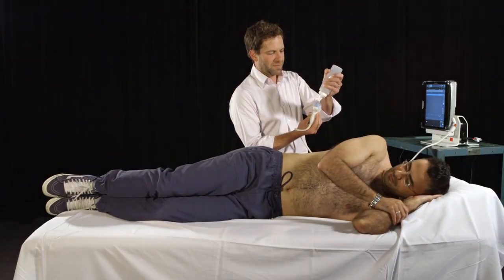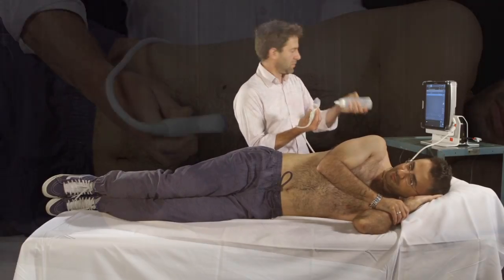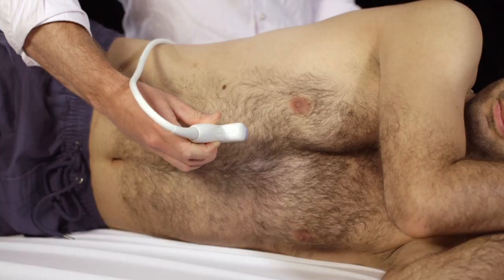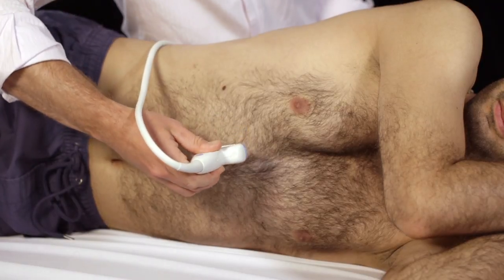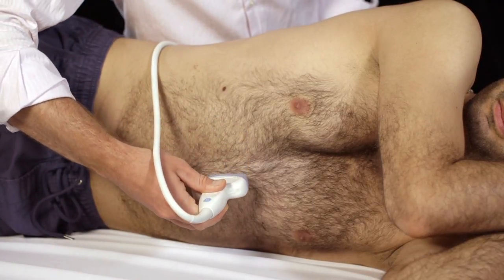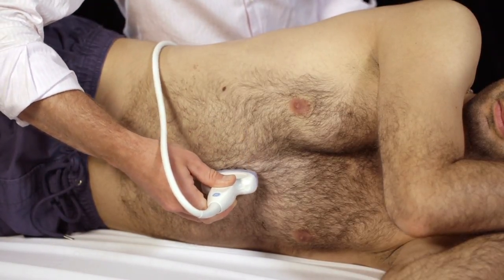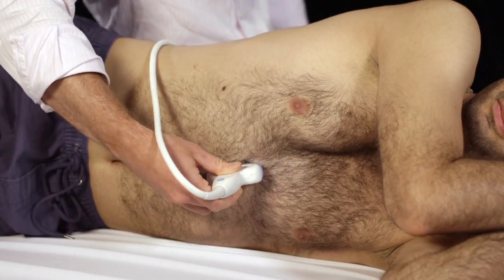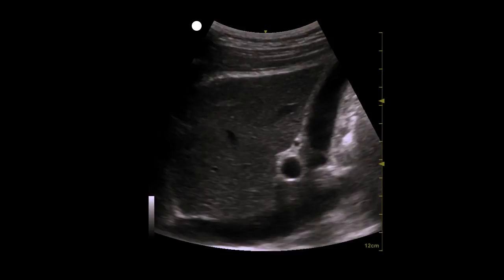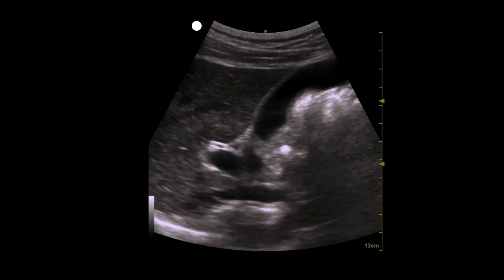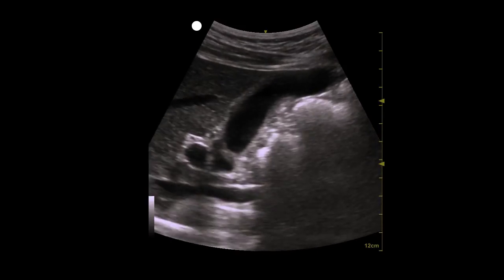Select the curved array or abdominal probe and hold the probe in the sagittal orientation. Ensure that the probe marker is directed toward the patient's head. Start your examination with the probe in the midline of the abdomen just below the xiphoid process. Identify the liver. You may need to slide the probe to place the liver in the upper portion of the screen.